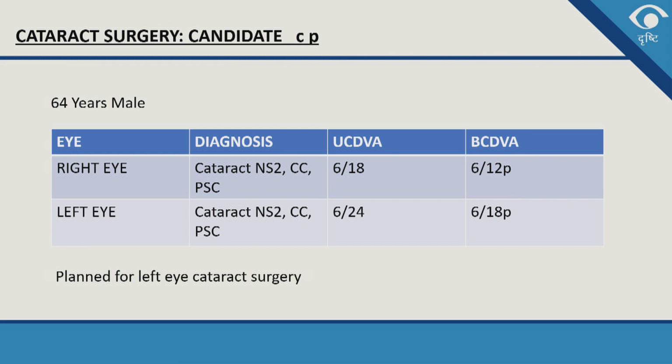Next, we have with us Dr. Gaurav Luthra. We are starting with a J&J session. This is the first case where we are starting with the Catalyst.